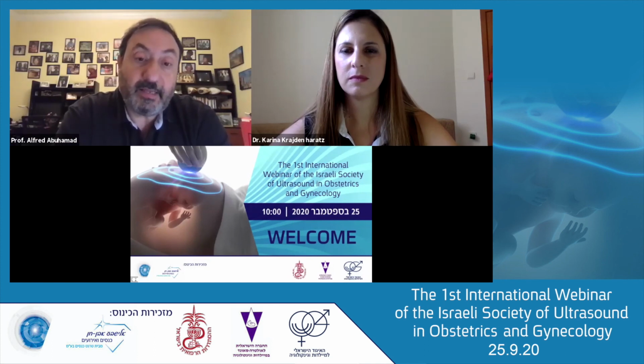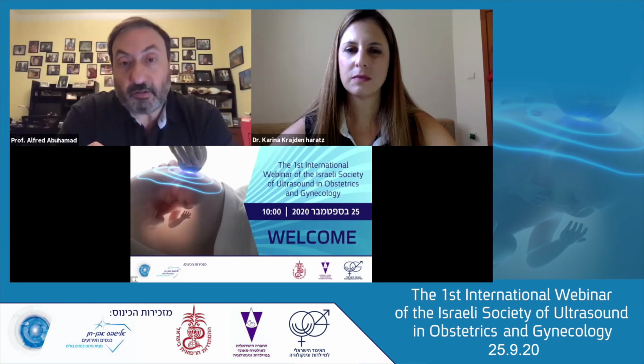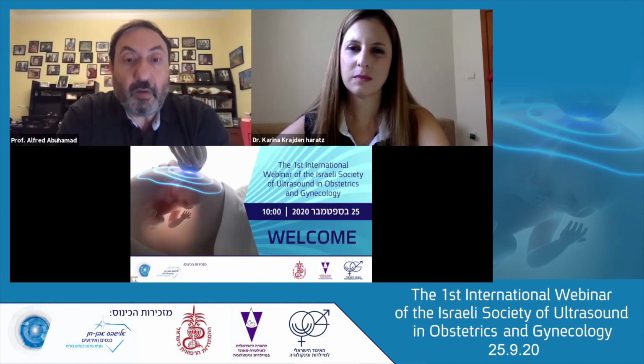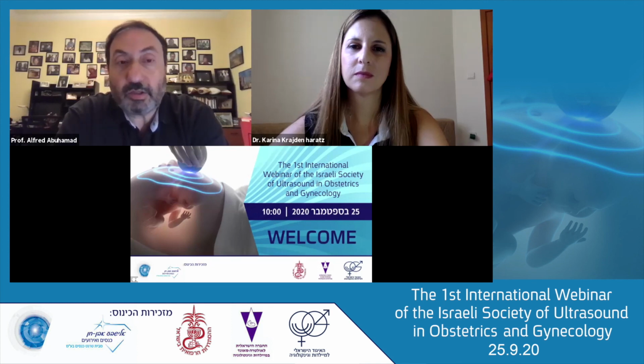Now, a VSD that is an inlet VSD in the first trimester is important to evaluate for the presence of atrioventricular septal defect. So here we look at regurgitation across the AV valve. We look at some of the markers to suspect the presence of AVSD early on, but we don't really look for them.